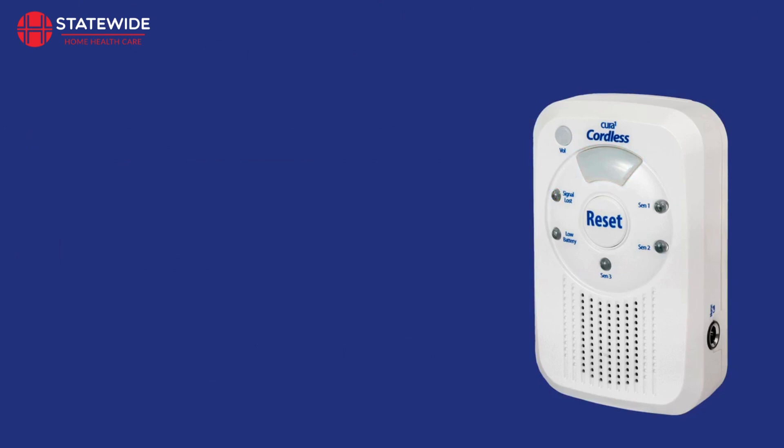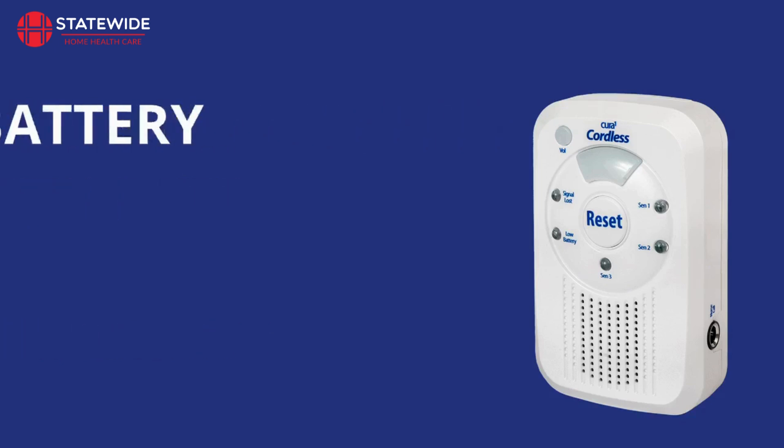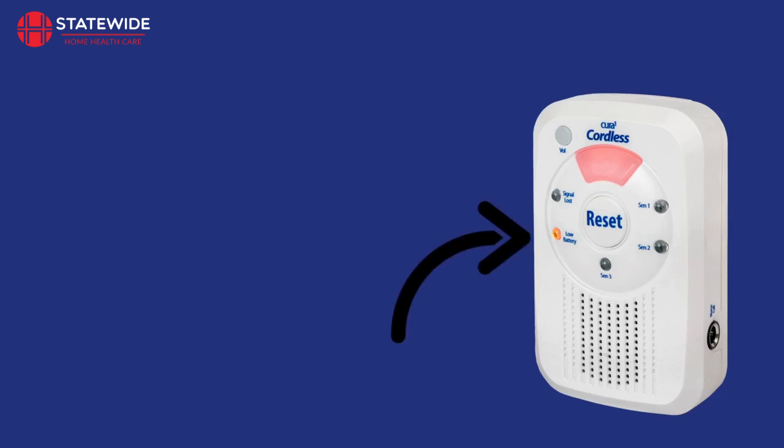The average battery lifetime of a 3-channel monitor is around 3 to 6 months, but is dependent on usage. When the battery becomes low, the monitor will beep intermittently and the low battery indicator will illuminate. The monitor will continue to beep until the batteries have been replaced.